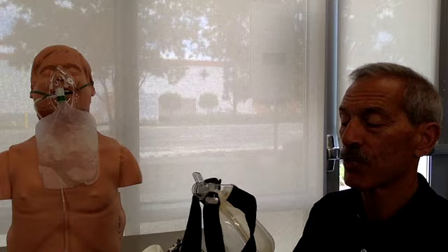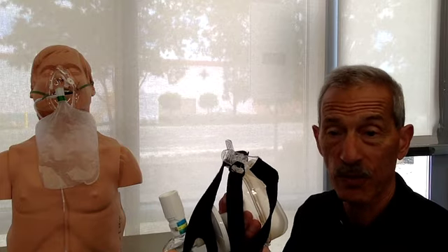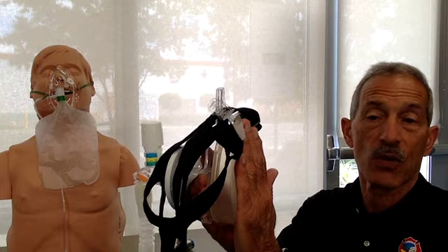They might feel a little claustrophobic at first. So I'm going to have them essentially hold this in their own hand, and I'm going to put this on their own face. Remember, they're awake, alert, and cooperative, so they should be able to do this. Have them hold it to their face until they feel comfortable with it. They might take it off for a few seconds, but put it back on. Encourage them to get comfortable with the device. Once they can tolerate it, the straps go on over the back of the head and clip on the sides here, and then you secure the Velcro down until there's a comfortable seal around the person's nose and mouth. And of course, it's resting on the forehead.